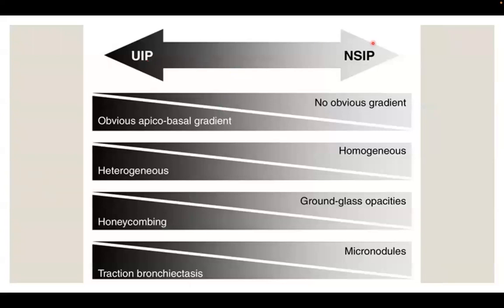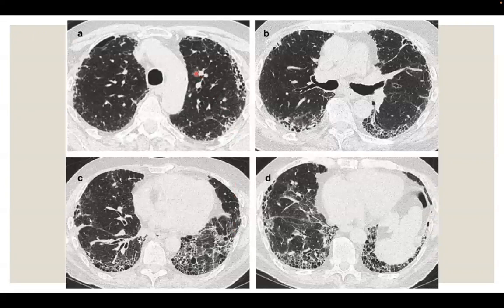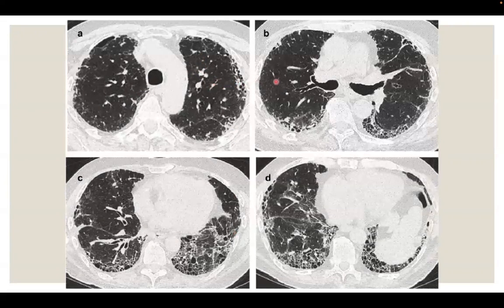UIP and NSIP both belong to chronic fibrosis and interstitial pneumonia, so there is always comparison between them. In UIP, there is obvious apico-basal gradient with heterogeneity of findings. Honeycombing is the main feature of UIP along with traction bronchiectasis. We can appreciate the apico-basal gradient: honeycombing increases from image A to B to C to D, which shows the maximum extent of honeycombing.